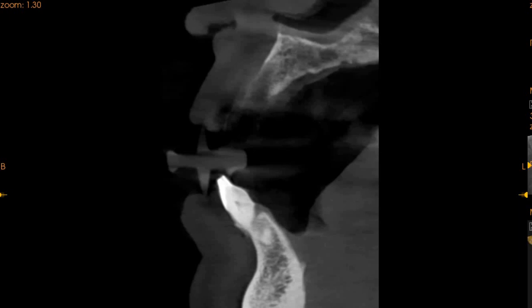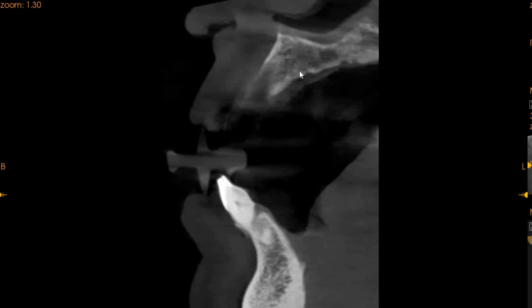Implant placement will be possible if the doctor can augment the buccal plate with either a cortical plate or with a bone grafting procedure. The ridge width approximately in this region is 5 mm, whereas the height is approximately 13 mm. So we have good engagement area in the apical region and the implant can be engaged here with a little bit of bone augmentation on the buccal surface.